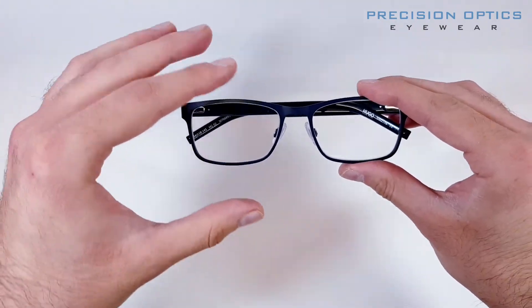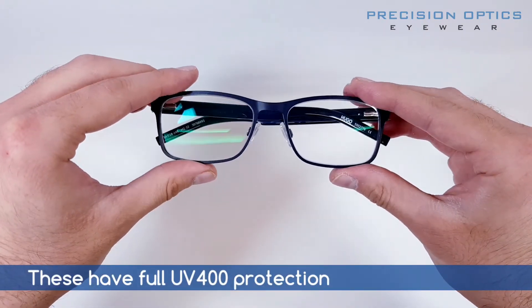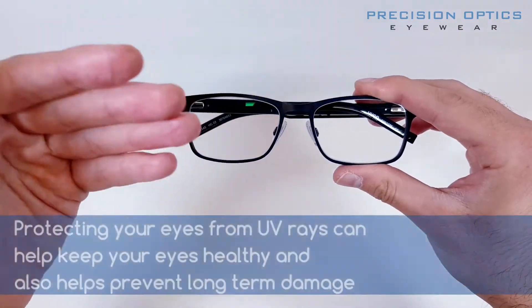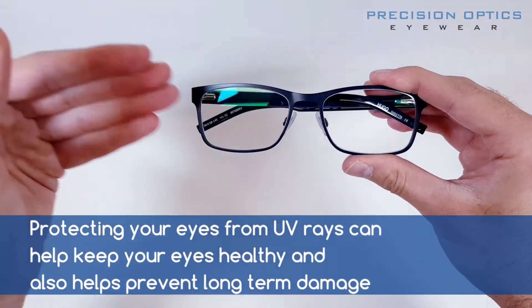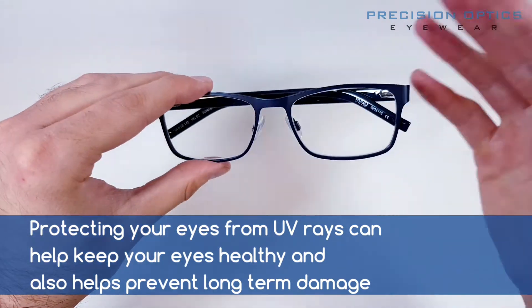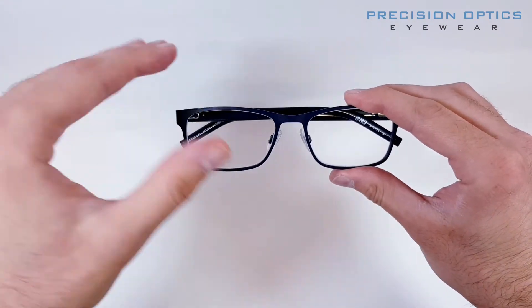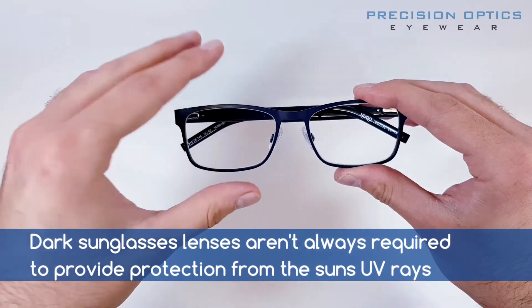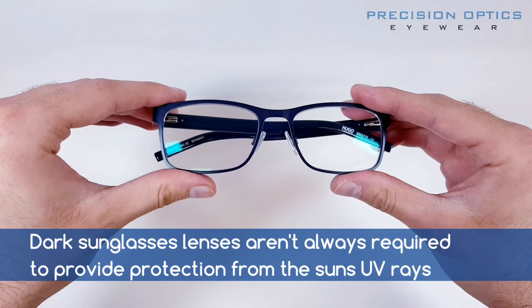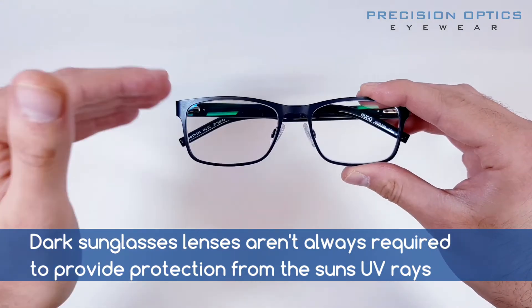With high index lenses, we also include UV400 protection, which is basically sun cream for your eyes. It's really important because your eyes are constantly exposed to UV. Having this embedded into the lenses as standard with a high index lens gives you that extra layer of protection. These won't go dark in the sun — they'll stay permanently clear, but you've still got full UV protection.